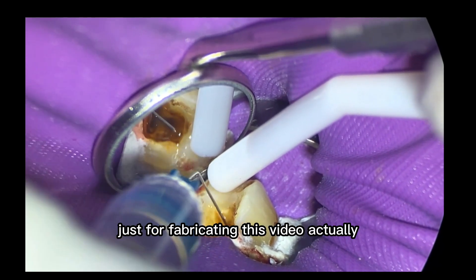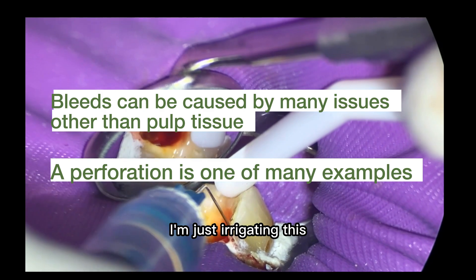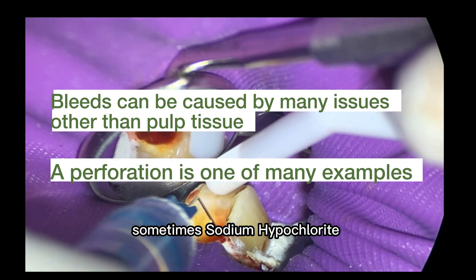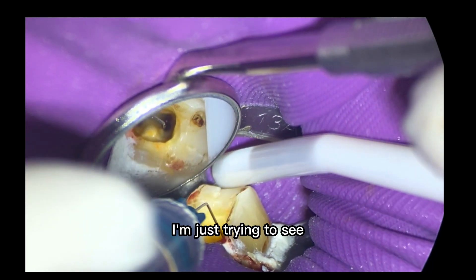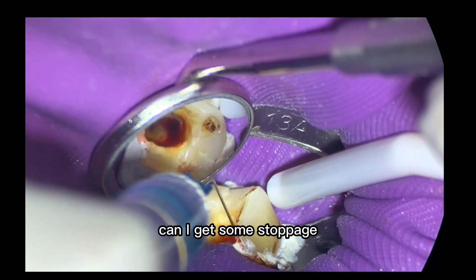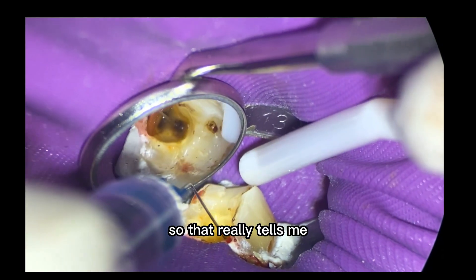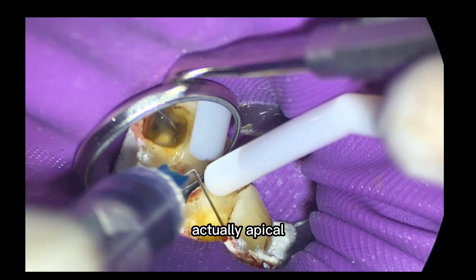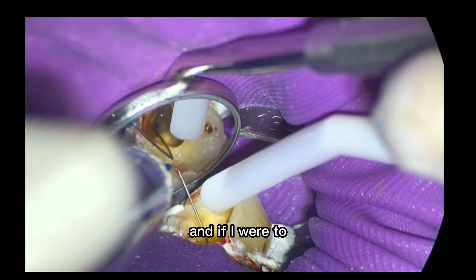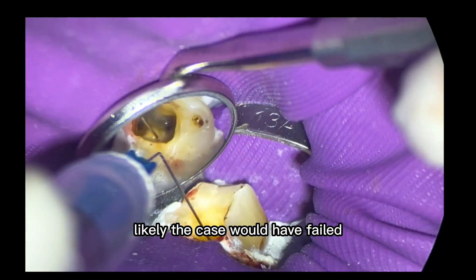What we're doing now is I'm just irrigating this to try to use some sodium hypochlorite — sometimes it can stop bleeds. Can I get some stoppage of the hemorrhage by just irrigating? The answer is no. It is not stopping. So that really tells me it's not so much a PDL bleed, but we've got actual apical pulp tissue down there. And if I were to go ahead and just finish the case, likely the case would have failed.